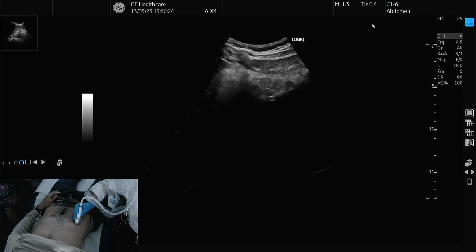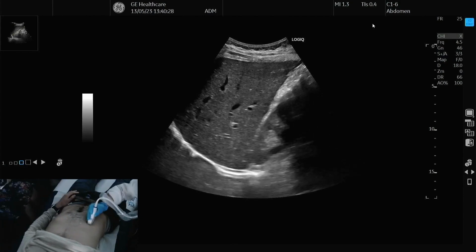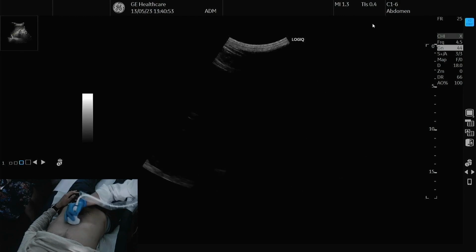I ask the patient to draw a lot of air into the chest, and in the area where I see approximately the right lobe as the patient breathes, I make an indicative measurement between where I suspect the diaphragm would be here and the lower edge of the liver, and in principle a normal liver should be below 15 centimeters. It may be plus or minus something, but basically we are also dealing with a normal liver here. After that it pulls, yeah, sure, cranially caudal.